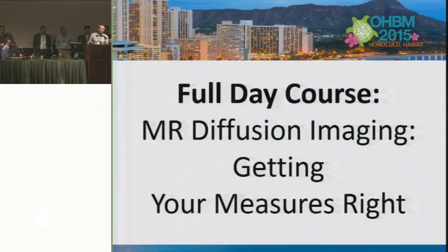Yeah. If you have these kids that are moving a lot, then you can design your scheme file so that in your acquisition you can afford to lose some of the directions. I think it's Phil Cook who has a paper on how you can organize your scheme file so that if there's a lot of motion, you can just restrict and still have a nice tensor fit. So that is one thing to account for in that situation.